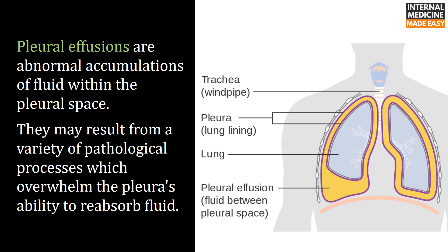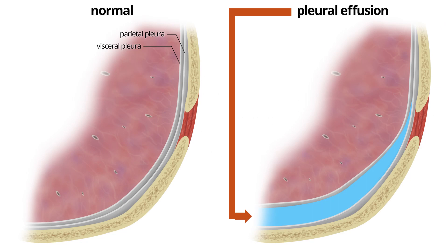Pleural effusions are abnormal accumulations of fluid within the pleural space. They may result from a variety of pathological processes which overwhelm the pleura's ability to reabsorb fluid. Here you can see the accumulation of fluid between the parietal pleura and the visceral pleura.